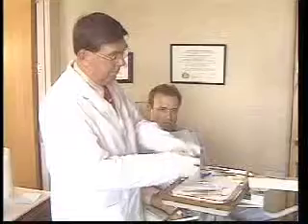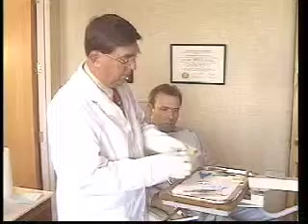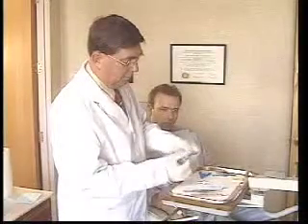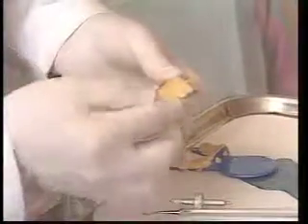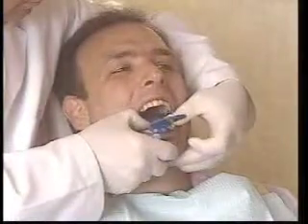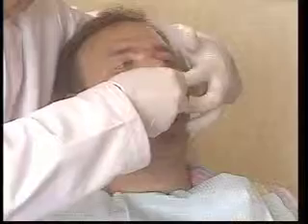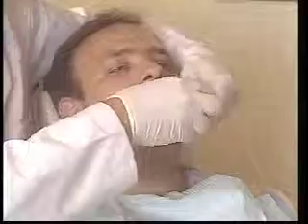To start the bite technique process, place impression putty in the upper and lower clutch plates. Insert the clutches. Place the separating plate between the two clutches. The separating plate keeps the putty material from commingling and locking the clutches together. Bite down.